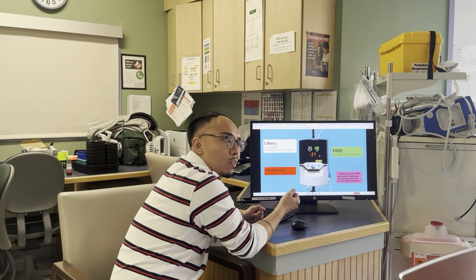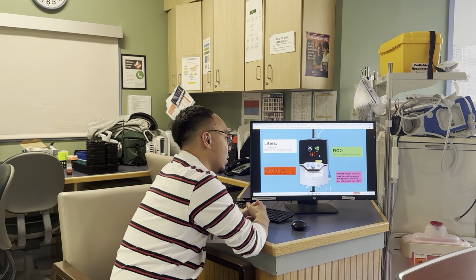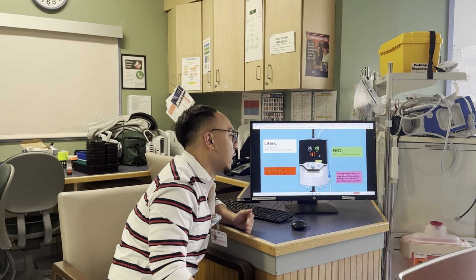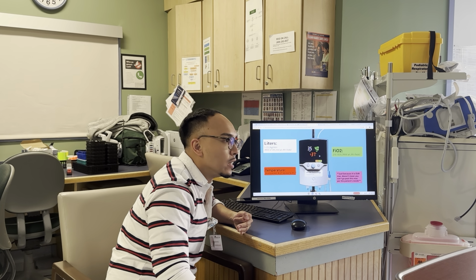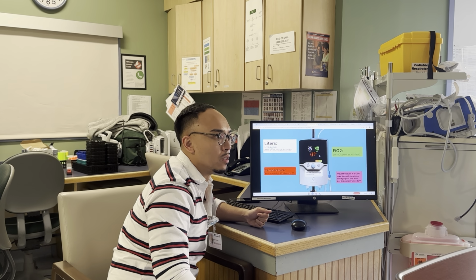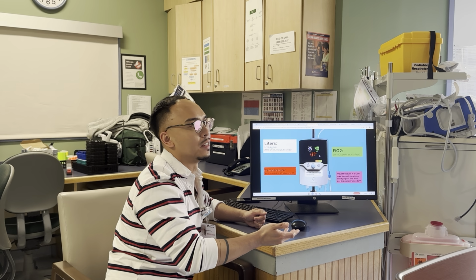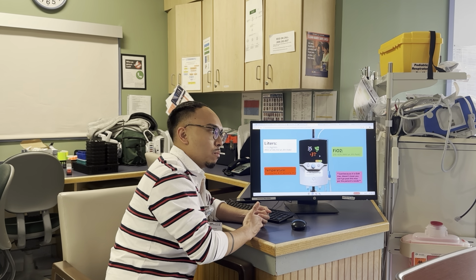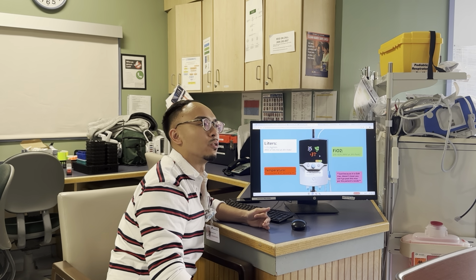Okay. FiO2 is between 21 and 50% here, but that doesn't necessarily mean you can't go above 50, it just means what? We need to transfer them out soon. And then temperature is adjusted by the RT, the recommended range is 36 to 37. And like I've been saying, just because it is our max, it doesn't mean you can't go past this max per the patient's needs. So if your kid's satting 89% and they're already on 50, you could bump up to 60, but you have to tell the physician, hey, we're at 60 now because we were satting 89, now he's going up to 91, but based on our protocol, we can only hold it up to 50%, so do we start considering transferring?